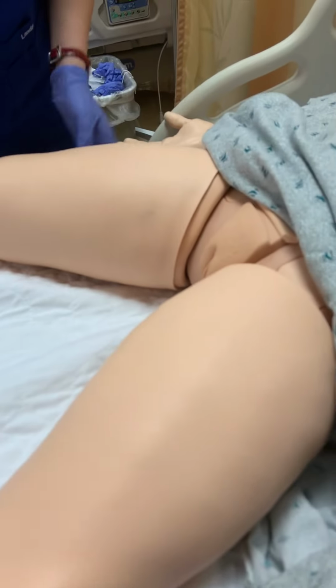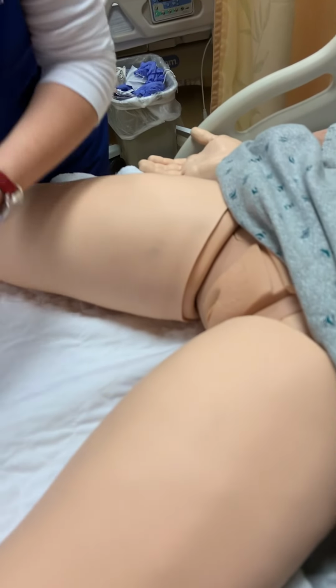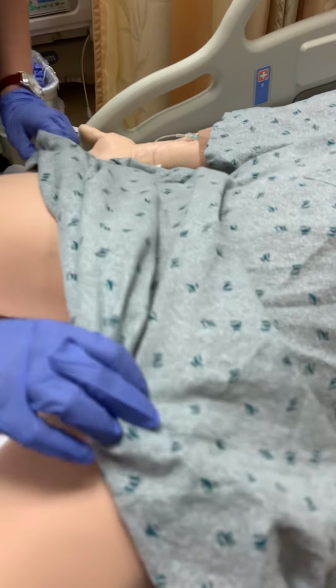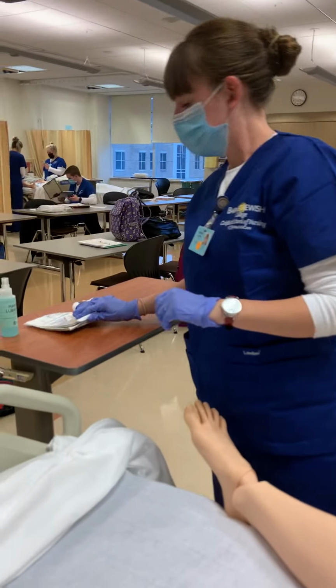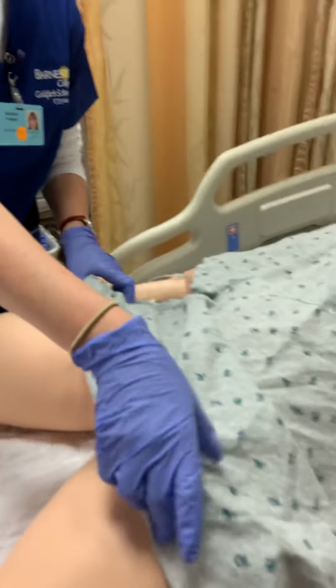Are you comfortable, or do I need to prop your legs up at all? That's okay. I'm good. You're good? Okay. All right. It looks like that area is clean, so I'm just going to cover you up just a little bit while I get everything else going. All my material here. Okay. All right.